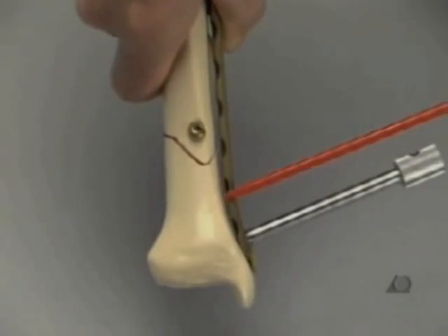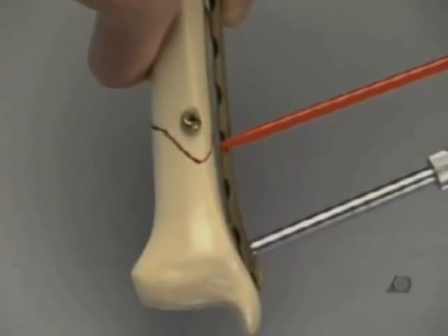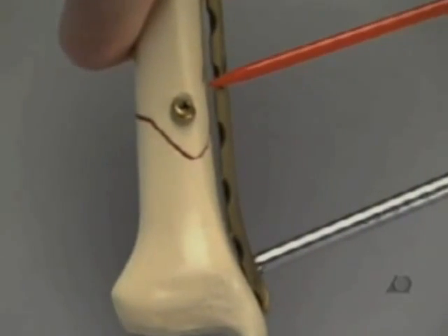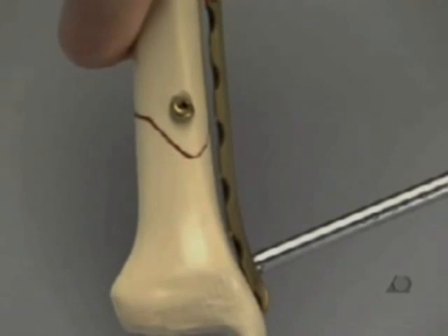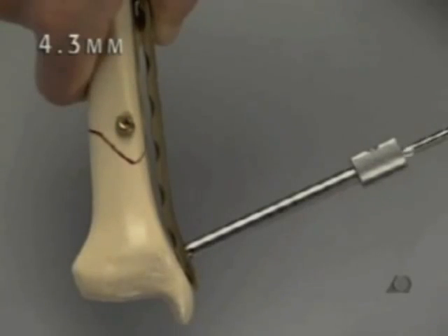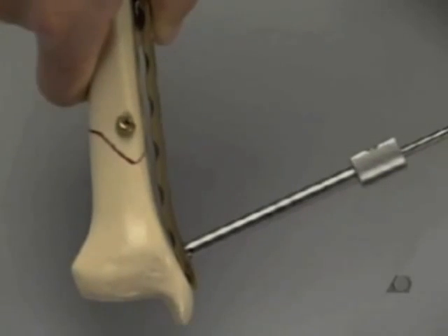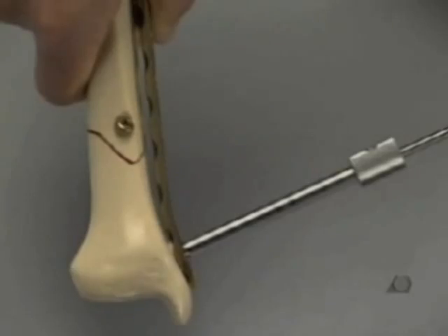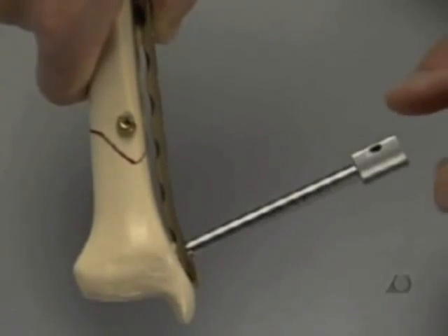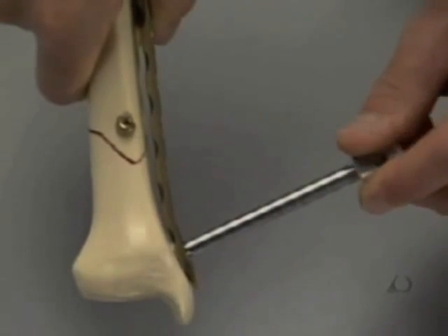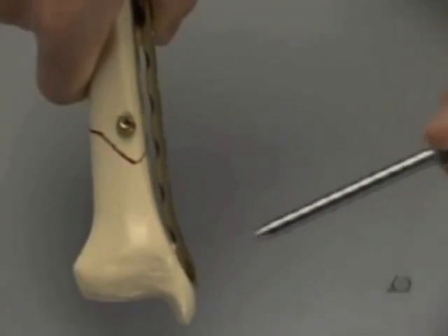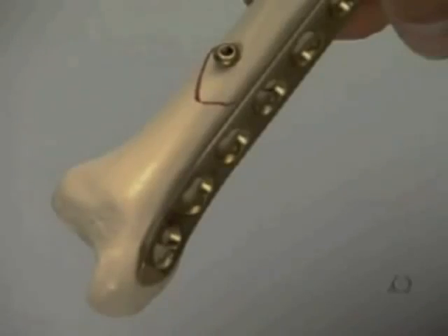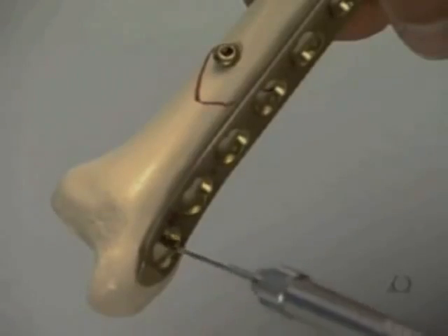Moving proximally, the plate does not touch the bone nor will it need any additional contouring or torque. The most distal hole is drilled with the 4.3 millimeter drill bit through the drill sleeve that has served as an insertion handle. The drill sleeve is removed and the length is measured with the depth gauge.